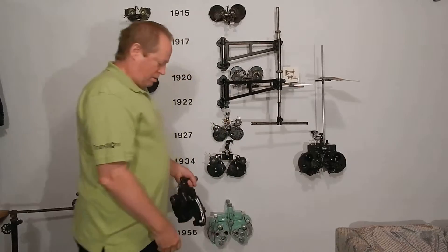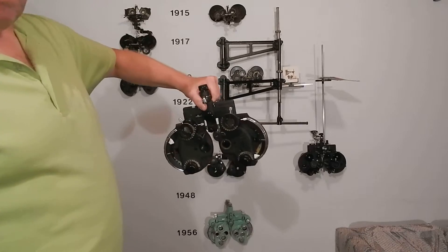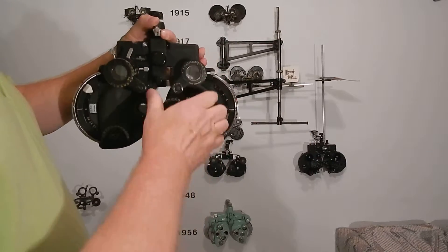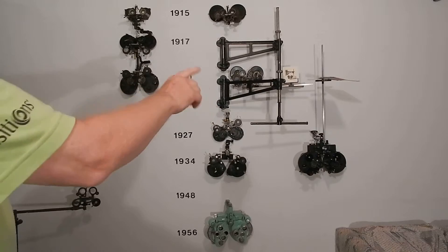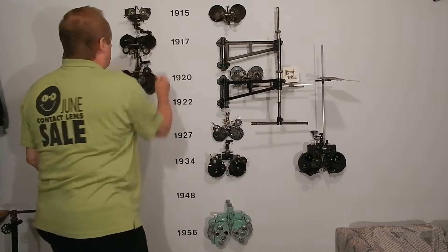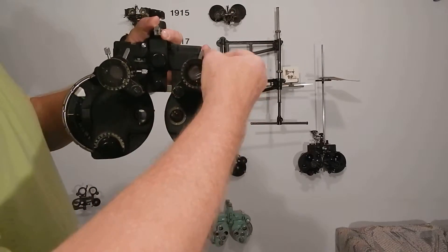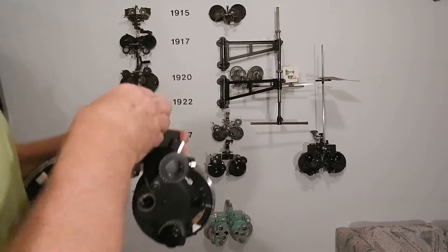A long time later, after making periscopes for submarines and all the optical work during World War II, AO came out with the 590, which is way better — really smooth. This is flat-out AO's attempt to make a Green's refractor; everything's the same. One big mistake: with the Green's refractor they had their own internal cylinder mechanism, but on this one when you turn it to the left, the cylinder goes to the right. You want 'which is better, one or two?' — you'd have to turn right to go left. Optometrists weren't going to appreciate that.